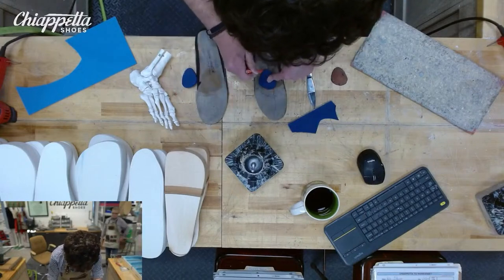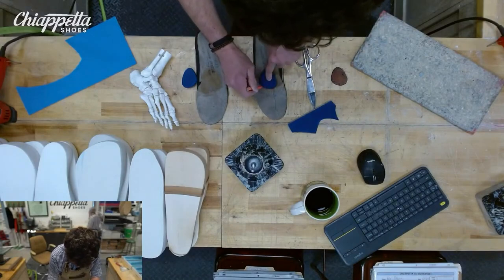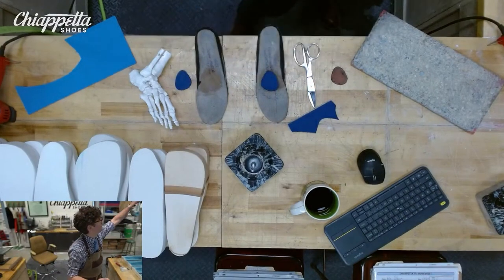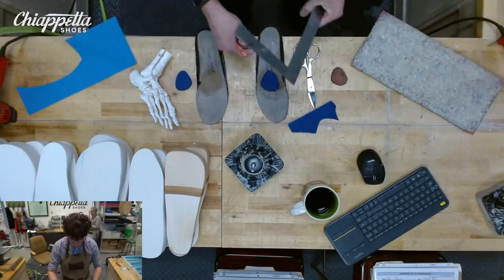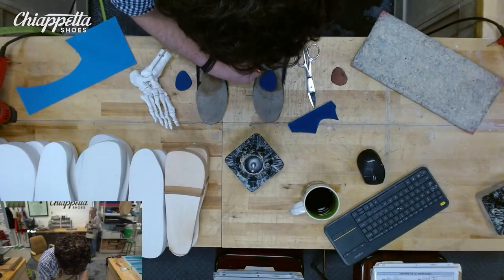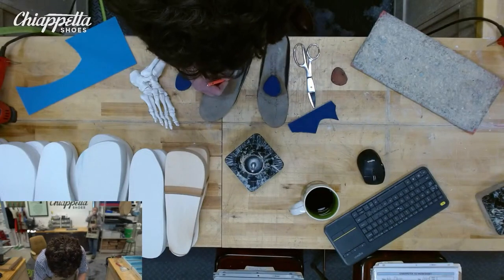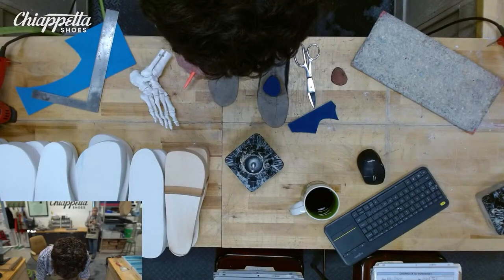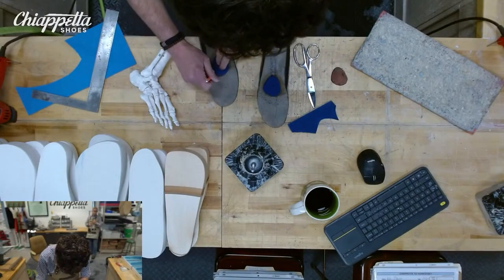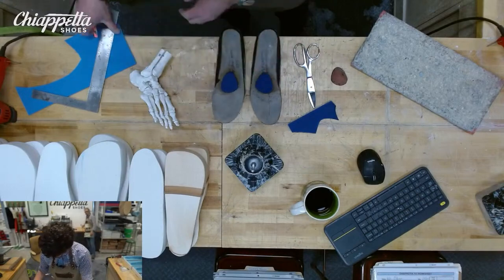And what I'm looking to achieve with that is a little bit more pronation control, midfoot stability. It's not that there's any abduction or adduction. We're just looking to provide a little bit more stability for that navicular bone, the old term scaphoid. So there's that. That's the new met pad.